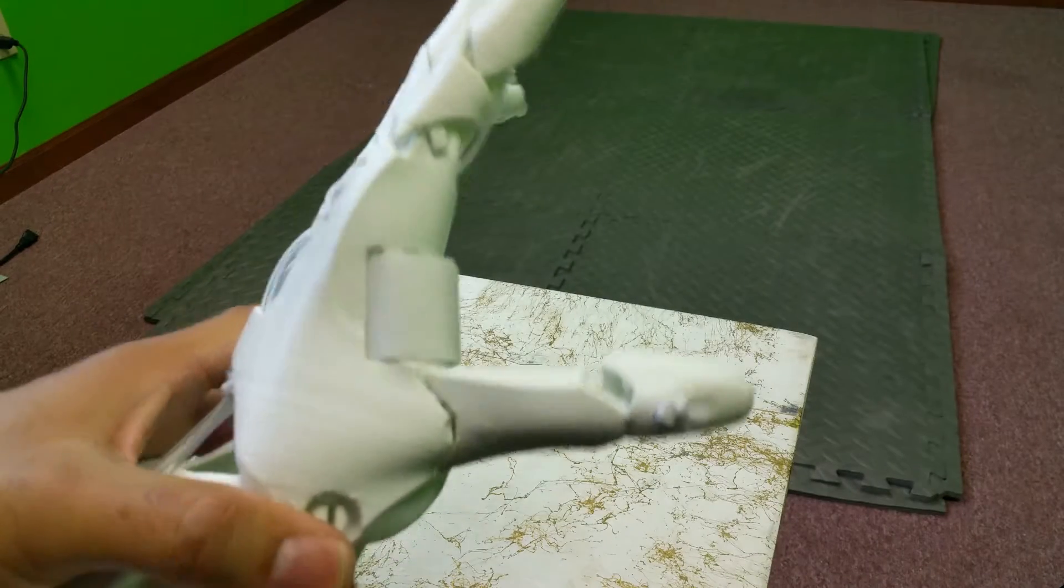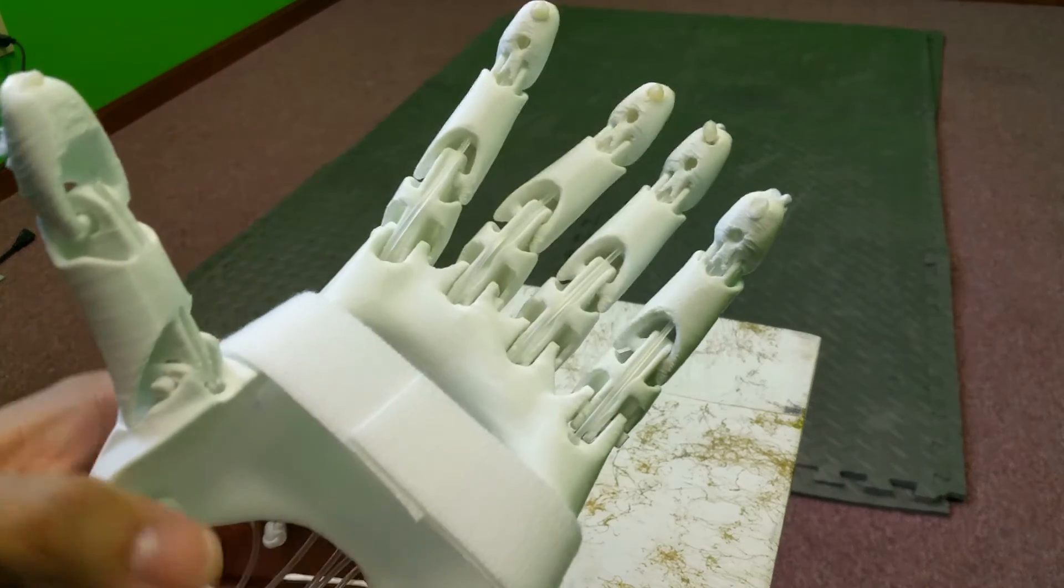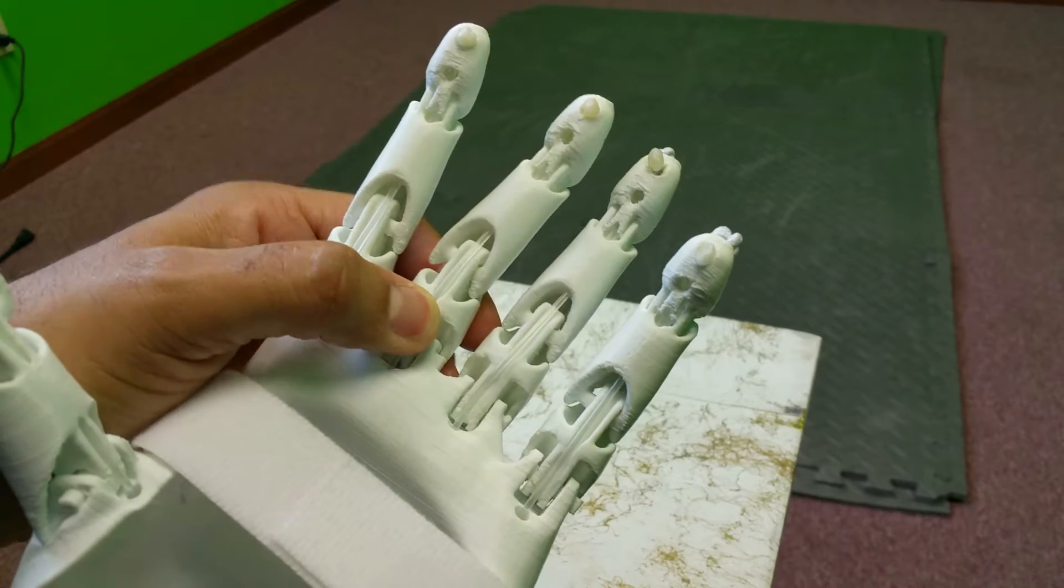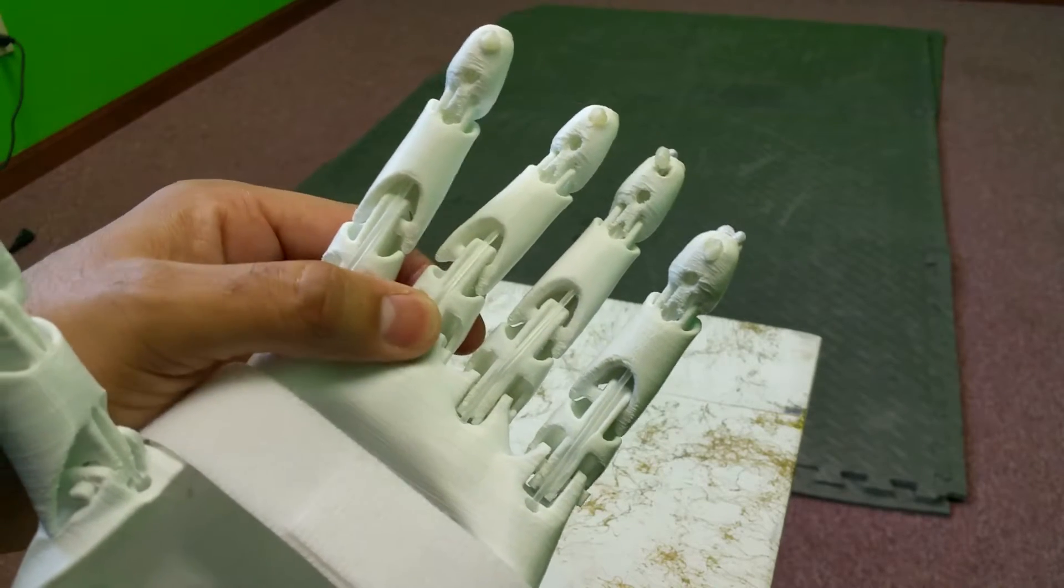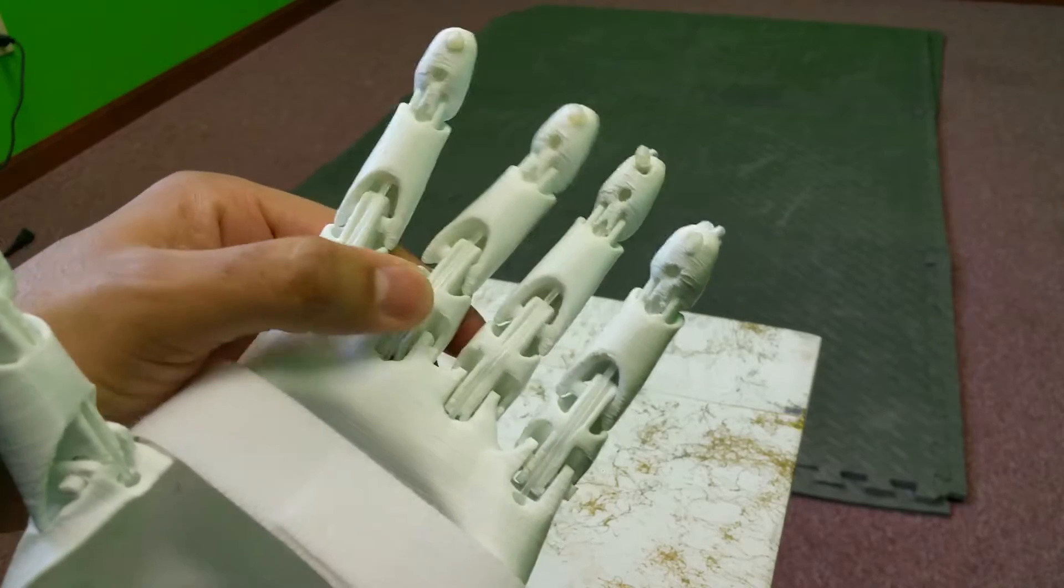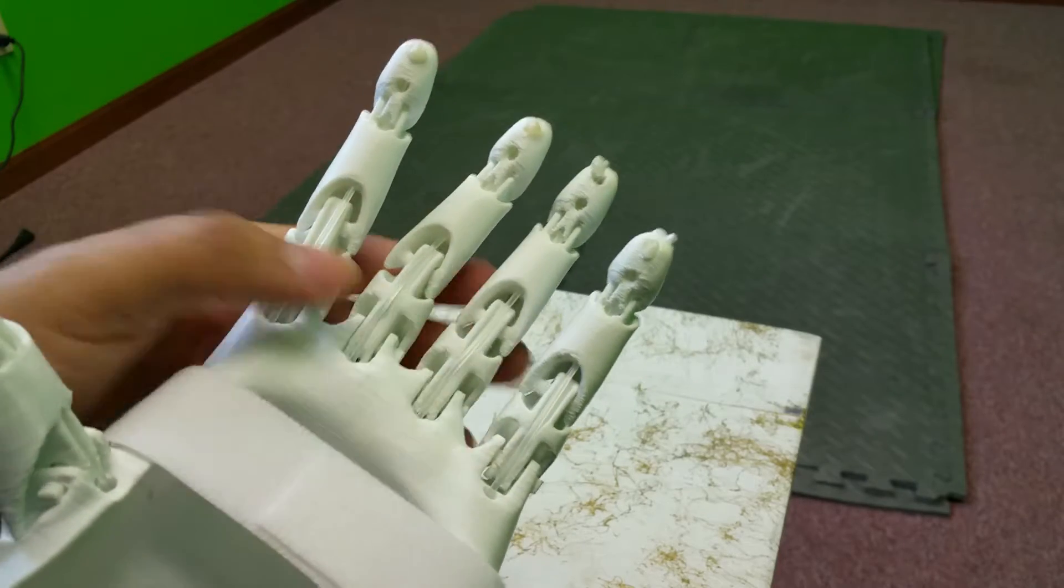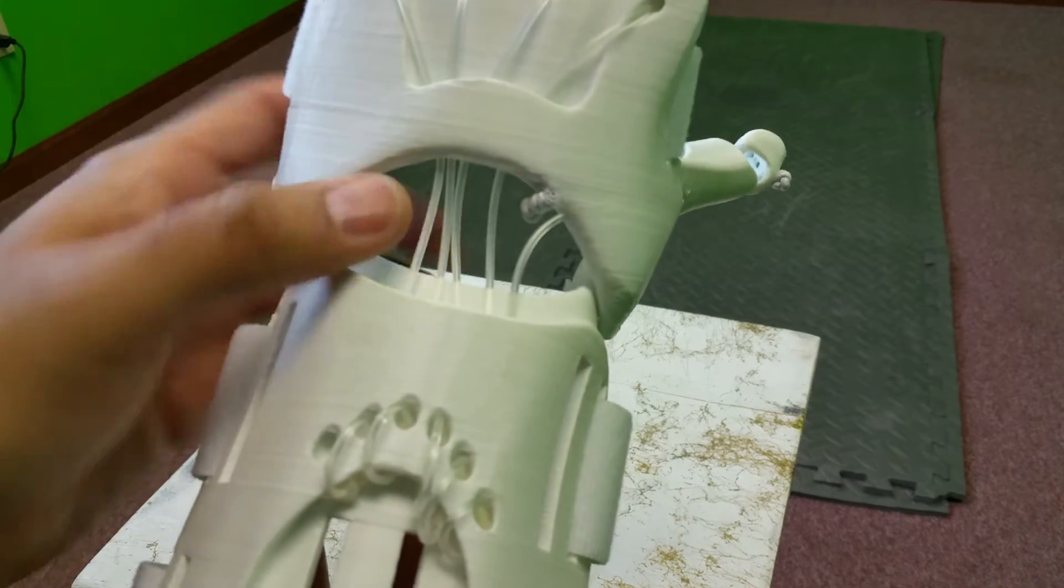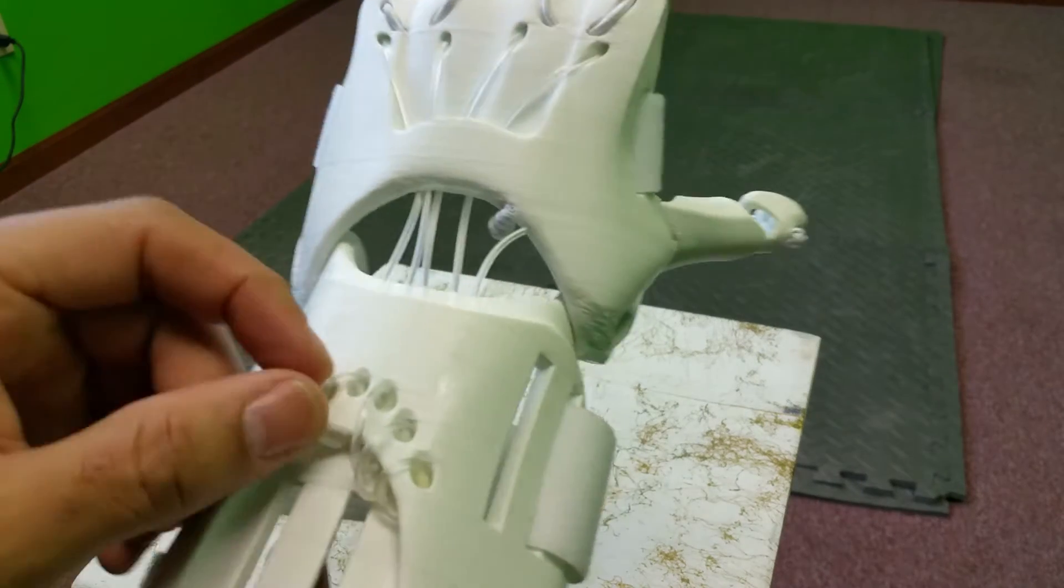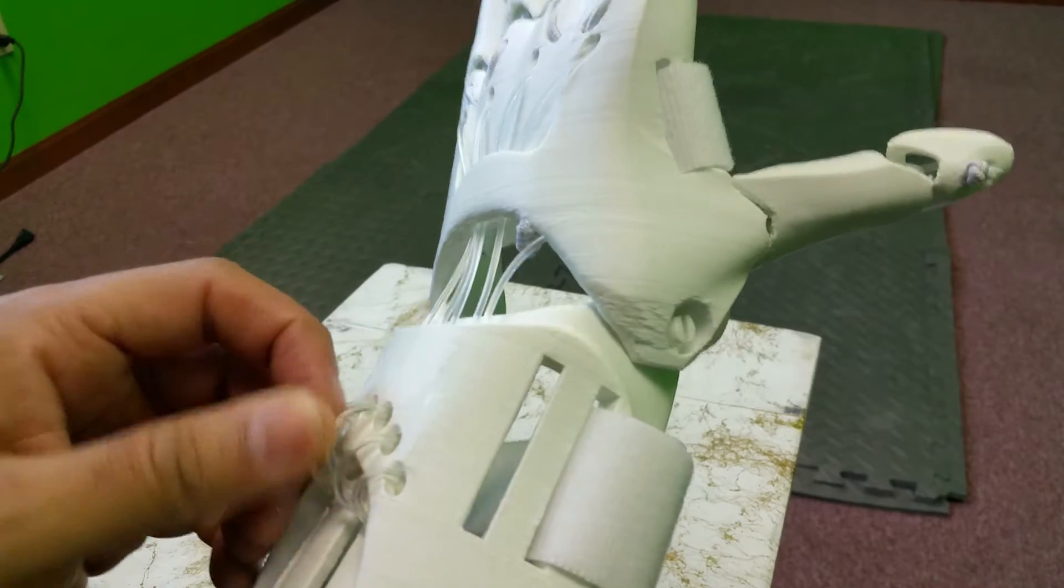One of the things we did different is we used bridge nylon in place of the twine or string. This allows for superior durability, superior function, and it's aesthetically pleasing, especially when you come into the front lines here. It just almost looks like fiber optic cable.